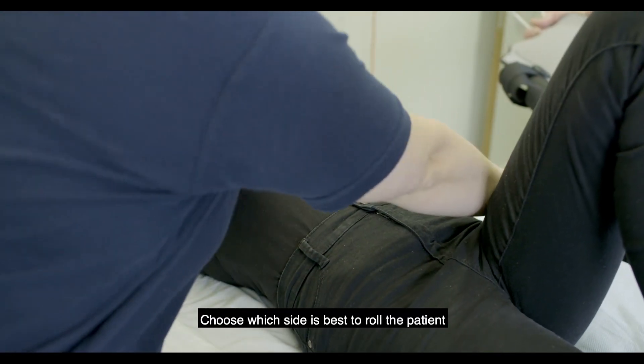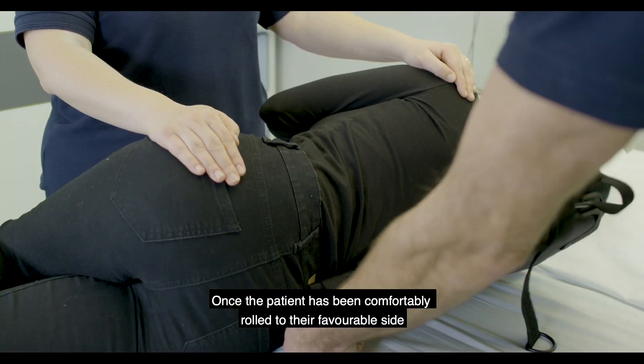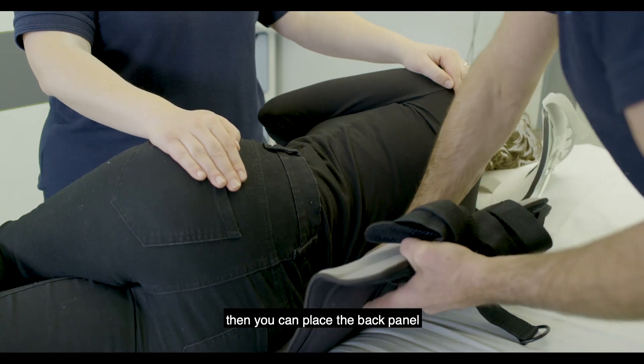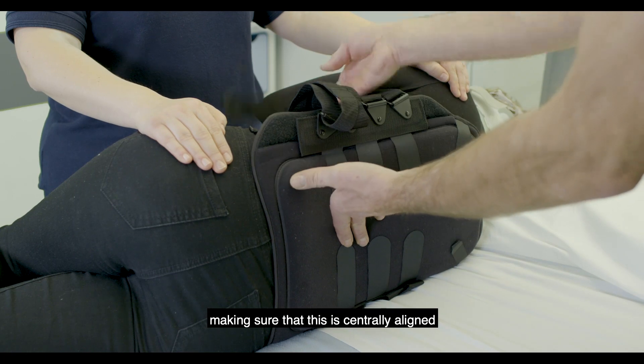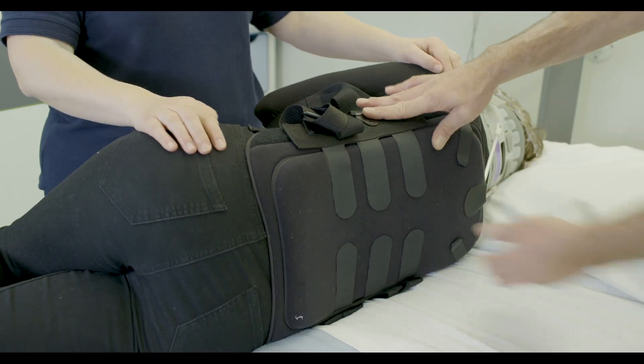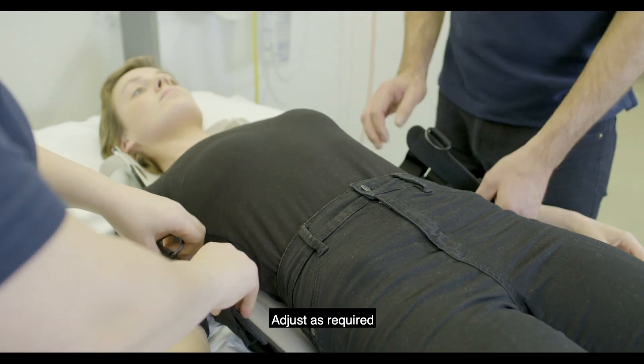Choose which side is best to roll the patient. Once the patient has been comfortably rolled to their favourable side, you can place the back panel making sure that this is centrally aligned. Roll the patient back onto their back and adjust as required.